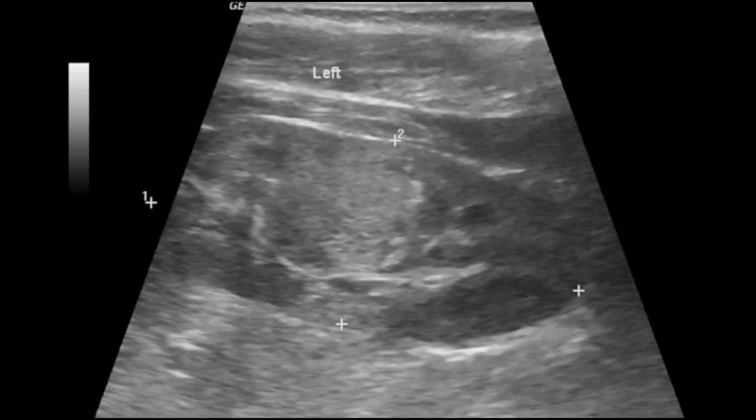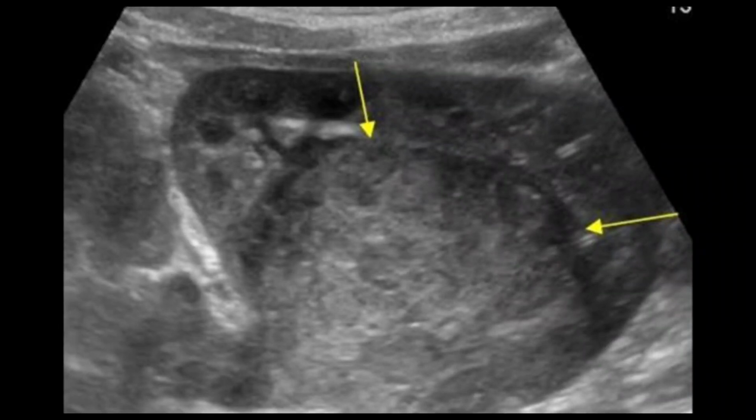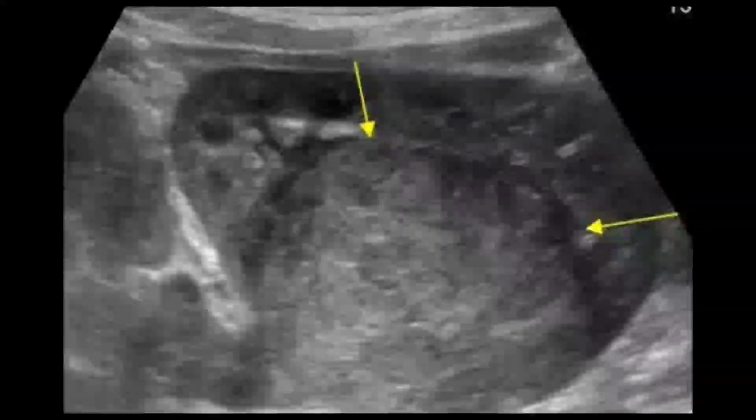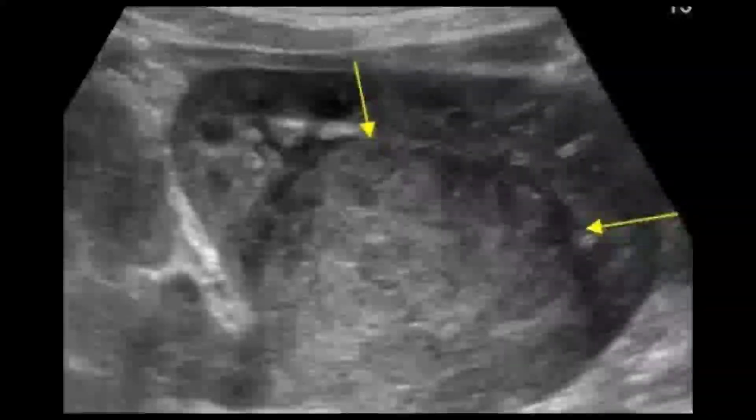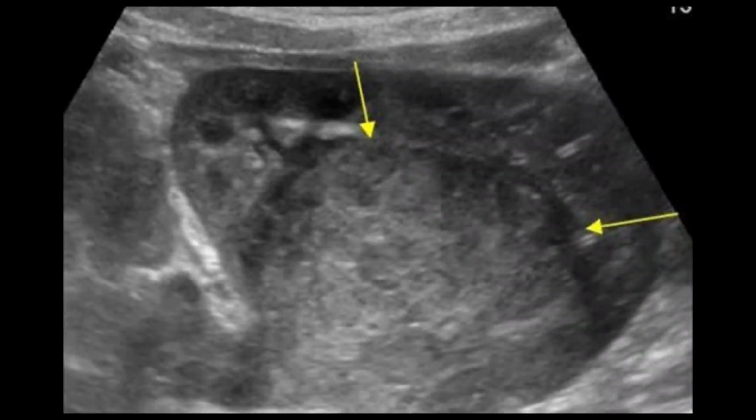But anyhow, you have to pay attention if you are going to find the Wilms tumor on ultrasound imaging. Here is a large Wilms tumor or nephroblastoma in a child of 4 years, and you can appreciate that it has grown bigger and involved the middle and the lower pole. Beside this, it is more towards the middle and it's crossing the pelvic region, or you can label it as extension into the pelvic region towards the ureter. So this is one of the important points worth noting.